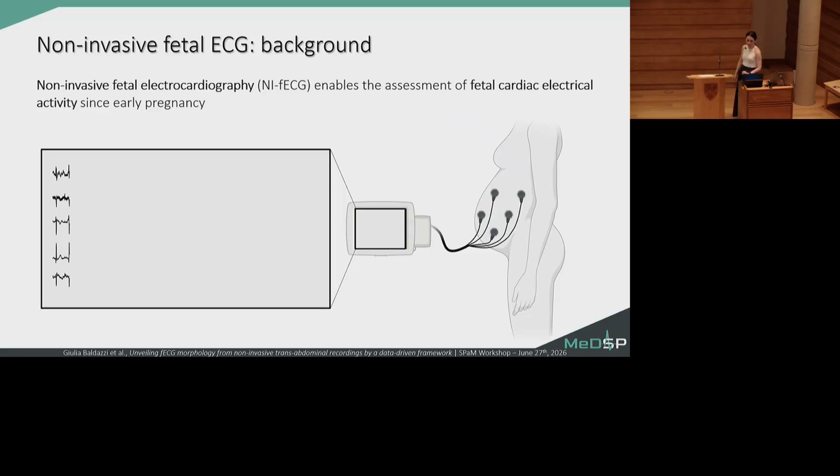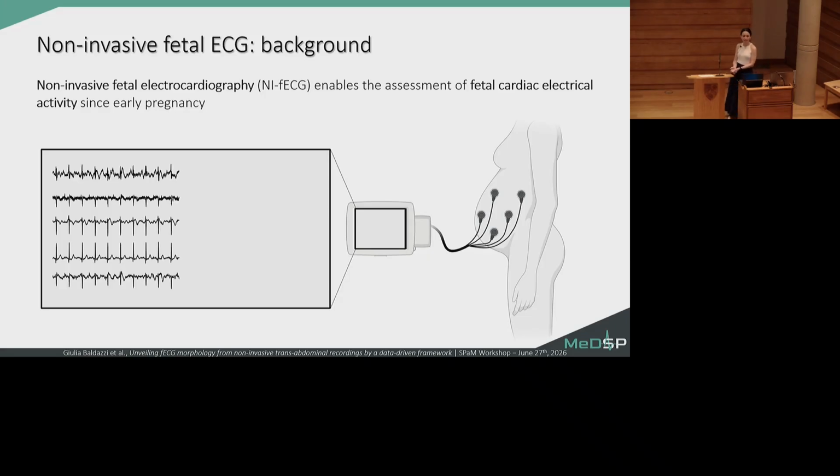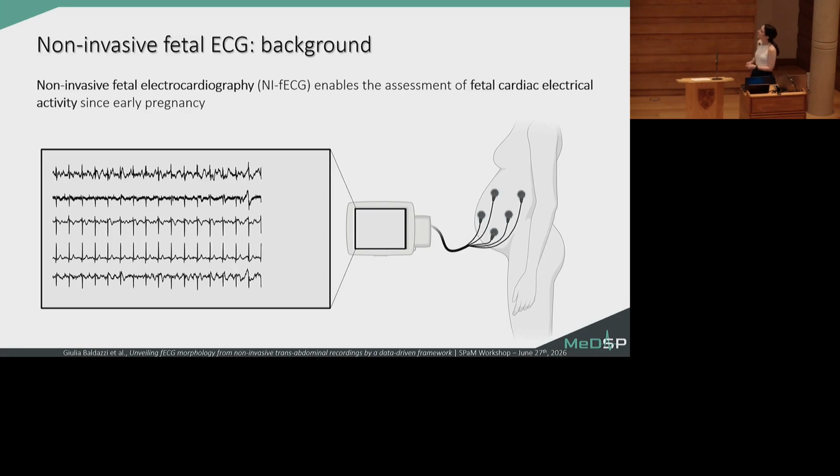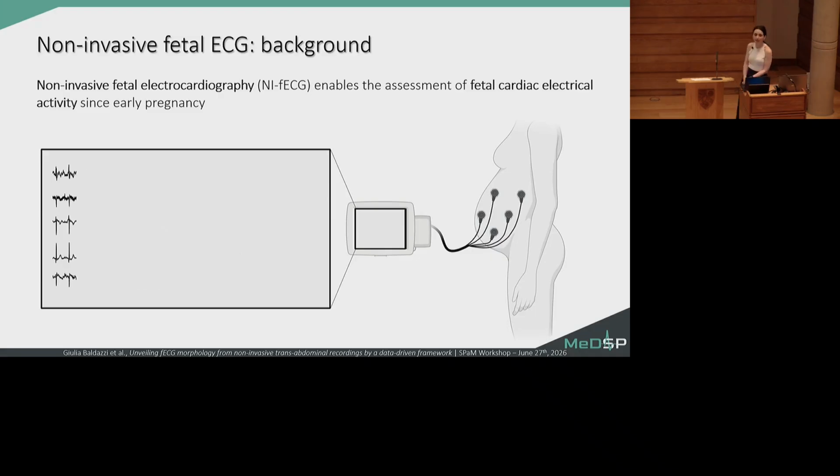So non-invasive fetal electrocardiography is actually a technique that enables the assessment of the fetal cardiac electrical activity since early pregnancy by recording the fetal ECG signals by simply applying some surface electrodes on the maternal abdomen.